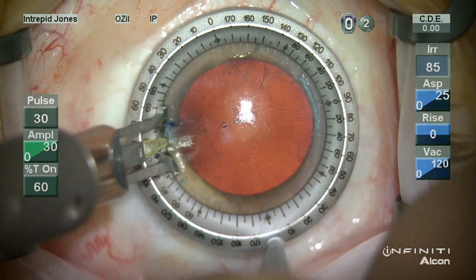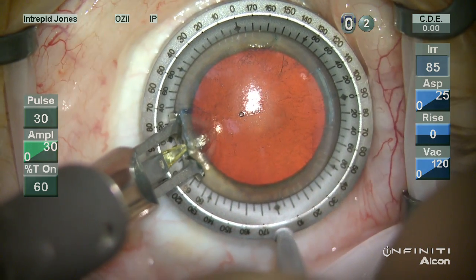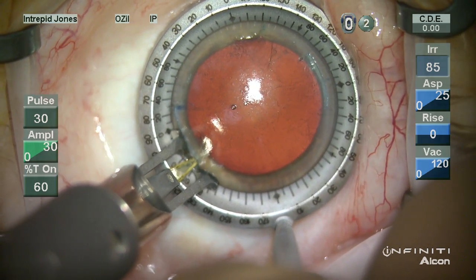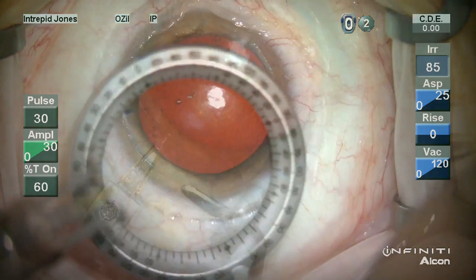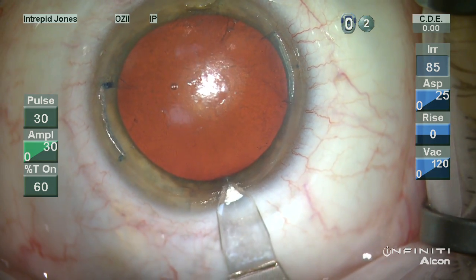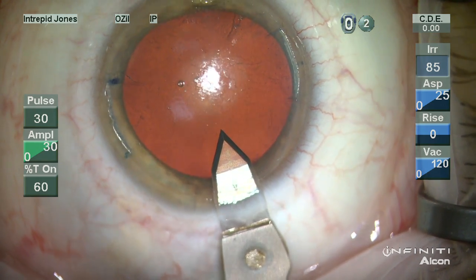On this side you can see that I'm once again incising towards me. I've not quite followed the arc of this ring device, which can be very helpful, so I've just relaxed my grip and continued on. Paracentesis and main wound are then fashioned in a routine manner, making sure that we use the reference mark for the main wound.